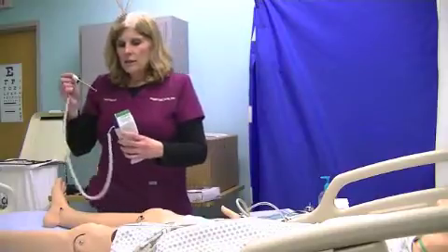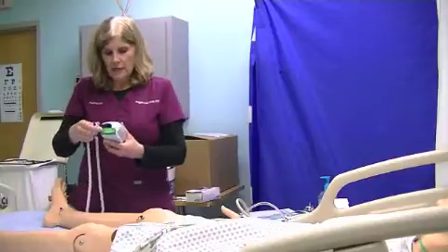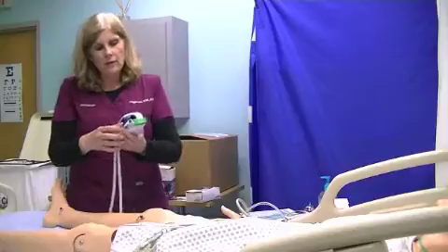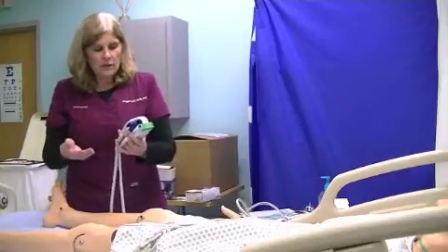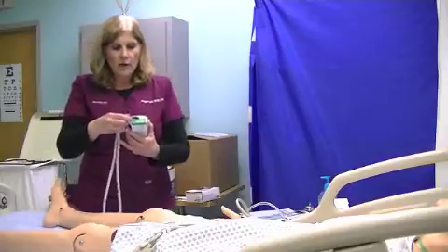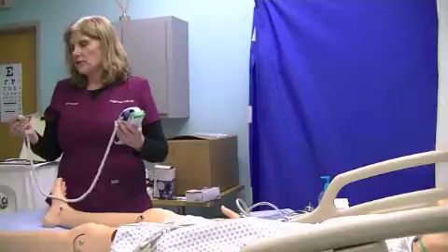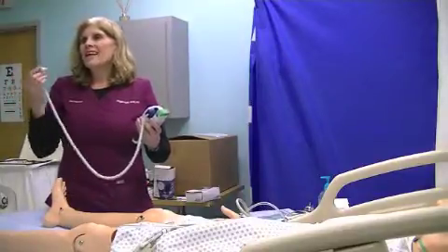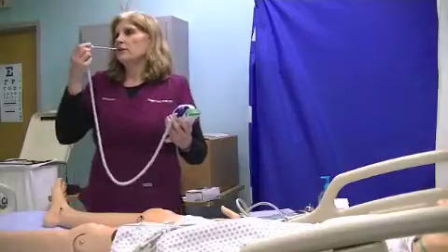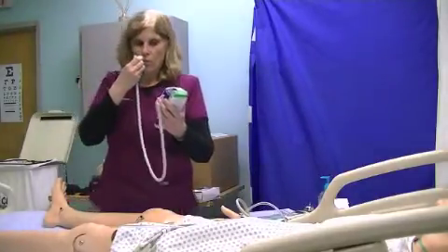Okay, with the oral temperature, you're going to make sure you put the sheath on the thermometer, and make sure it's set, the head is flashing. We usually use centigrade or Fahrenheit. You can do the calculation to change it, but most of the time we use Fahrenheit. We're going to make sure we put this sheath on. This covers it to prevent the transmission of infection. This goes underneath the tongue, where there are 4 vessels under there that read the temperature. And make sure you make a tight seal.